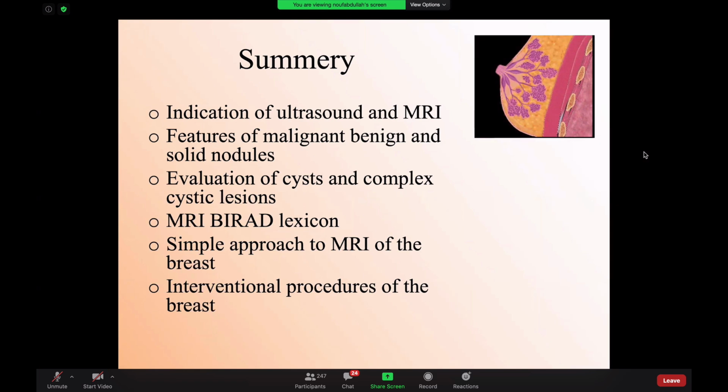I think it's a good thing to know about the update that rapid wash-in is suspicious for malignancy, but for exam purpose, I would always talk about the type of the curve. So progressive, washout, or plateau, because this is what comes in the last edition of BI-RADS, it does not state that wash-in is the only feature. Wash-in is very helpful in cases of screening breast MR, because in cases of screening, we do what we call abbreviated breast protocol, meaning that we do only the first 2 or 3 phases of breast MR.